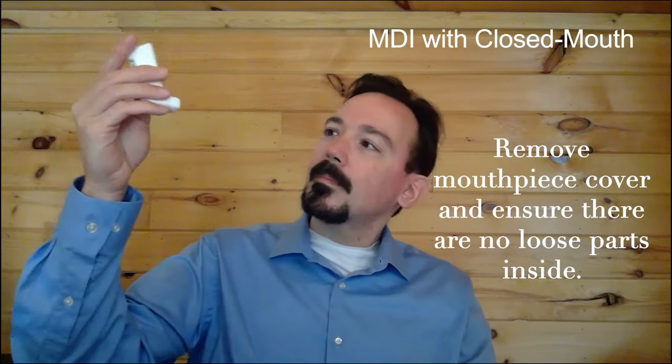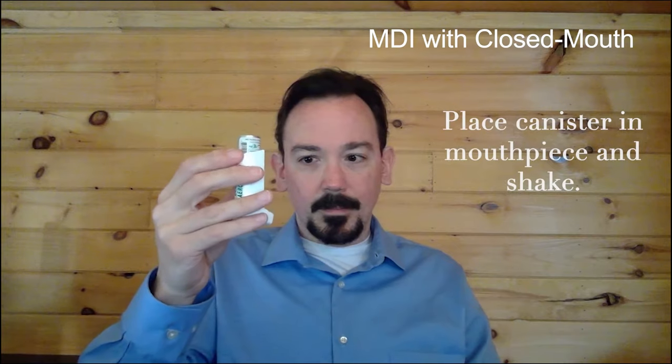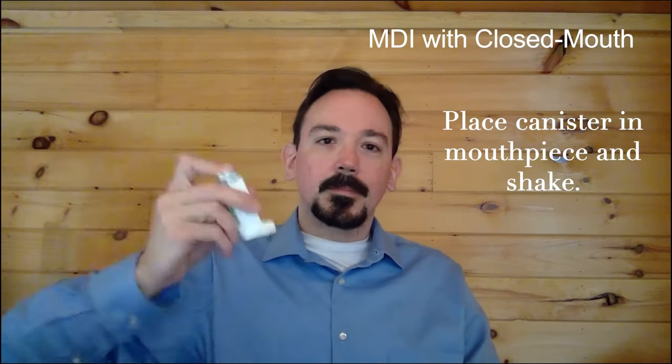Remove the mouthpiece cover and ensure that there are no loose parts inside. Place the canister into the mouthpiece and shake several times.